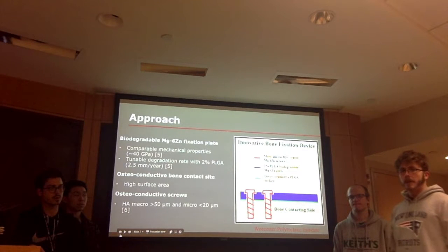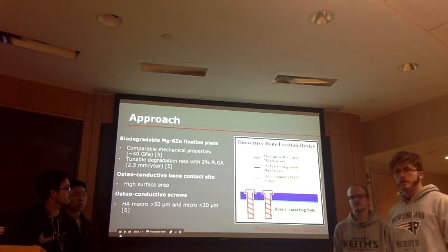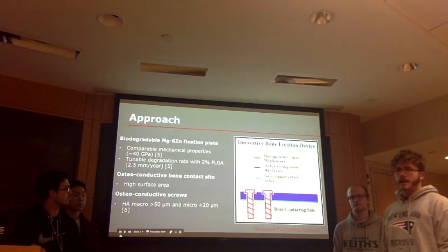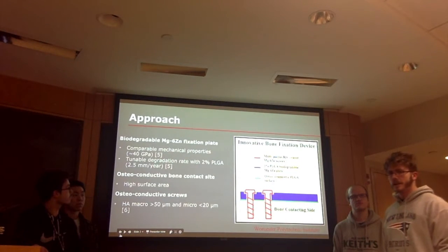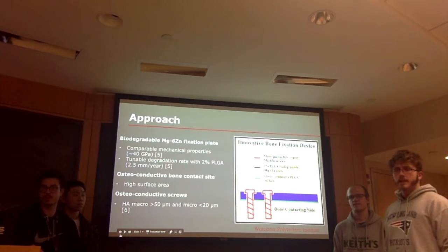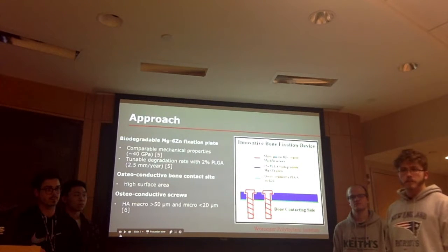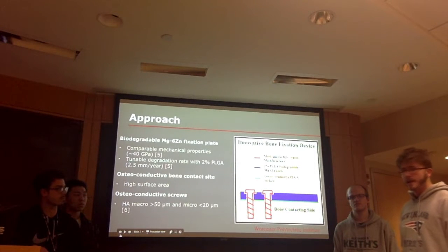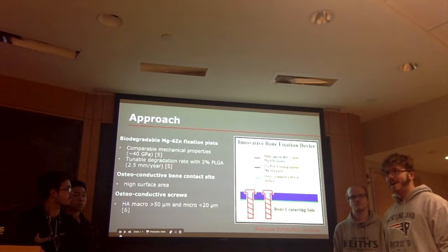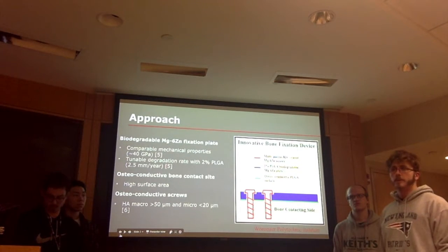We'll be able to achieve a patient-specific tunable degradation rate to match the patient's healing rate through the use of a 2% PLGA coating. And this will prevent any degradation for the first 6 months while allowing for a 2.5 millimeters per year degradation rate after. The bone contacting surface site will have a high surface area which will allow for osteoconduction. This prevents micromotion for the first 6 months, which is crucial for proper remodeling. The plate will be held in place through the use of multi-porous hydroxyapatite magnesium-coated screws that have larger pores for osteocyte infiltration as well as smaller pores for protein absorption.